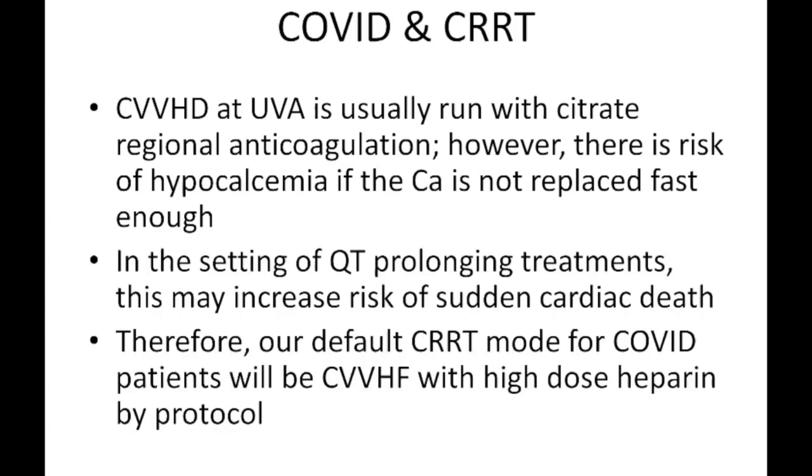So because of these reasons, middle molecule clearance and the risk of hypocalcemia, CVVHF will probably be our default choice with high dose heparin.